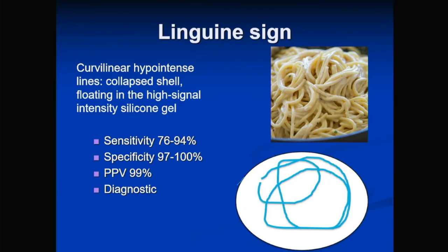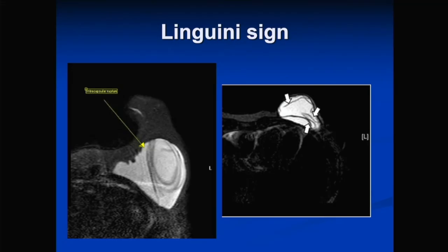The linguine sign — named after the pasta, which is flatter than spaghetti — occurs when the inner shell completely separates and floats freely within the gel, while the fibrous capsule remains intact. It is very specific and sensitive for intracapsular implant rupture. If you see the linguine sign, you can very confidently diagnose intracapsular rupture. You can see the membranes floating as lines inside the gel, visible in circles as membrane linings drifting within the implant.